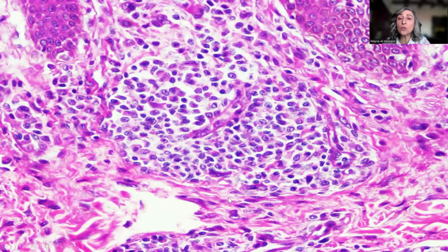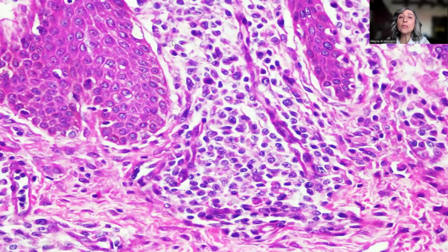And this is another field where we see the same kind of cells, and these are surrounding the blood vessels. And a third field, again a replica of the previous two fields, showing exactly the same morphology, where we have really this monotonous infiltrate. It's extremely important to remember this word: the infiltrate usually in lymphomas is monotonous. This is unlike the infiltrate that we see with dermatoses in general. There is a monotonous inflammatory cell infiltrate that we can identify from similar cells in one field to the other, with the larger nucleus and sometimes the prominent nucleolus.